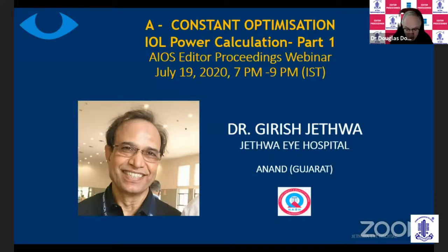It would cause a lot of bag contracture, and the lens would come forward or back. So I don't know that we can judge the accuracy to within a quarter diopter with that lens, because I think it's the wrong platform for it. And I think we're getting close to the point now where maybe we can start to think about quarter diopters because we're doing so well. But I thought that was a fantastic talk.